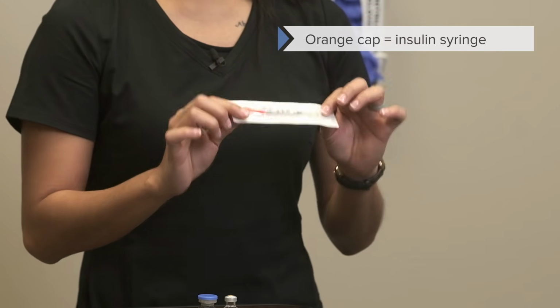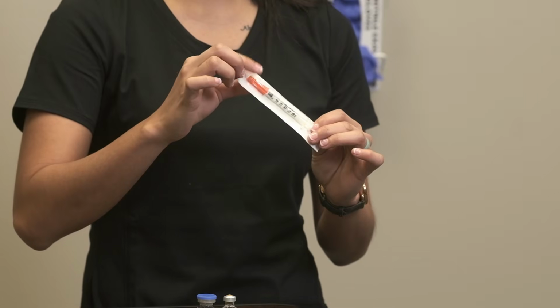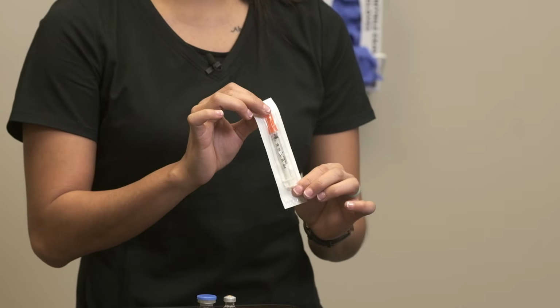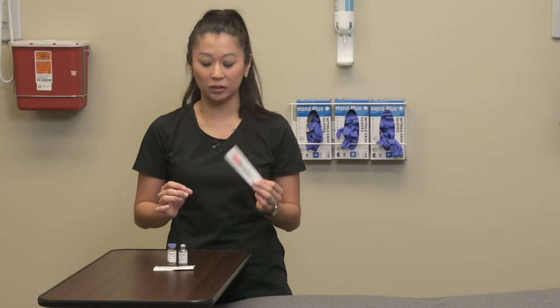When you see an orange cap, this is something to think of insulin. It's a great safety device, a great safety notification for us. Anytime you see an orange cap, think of an insulin needle, and that should be the only thing we draw up with this.